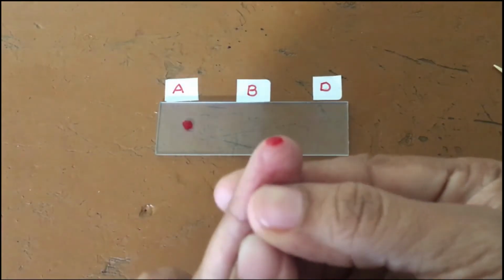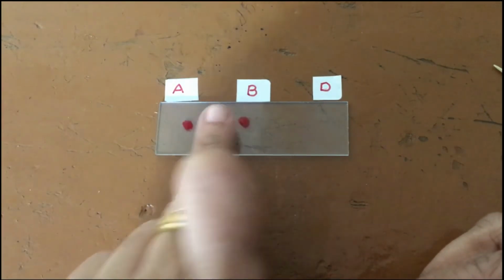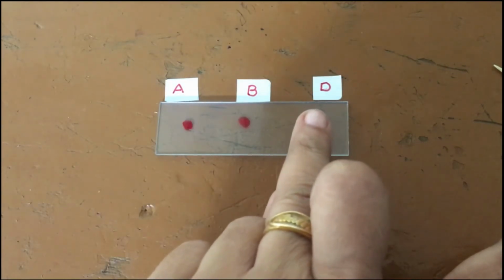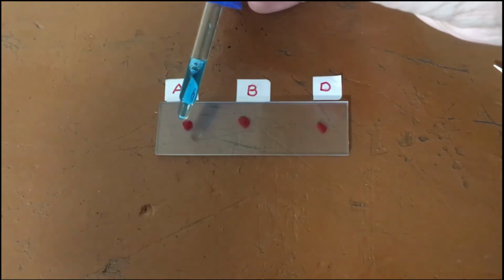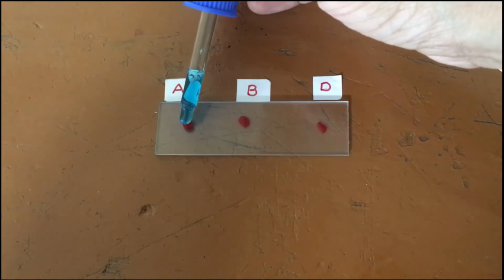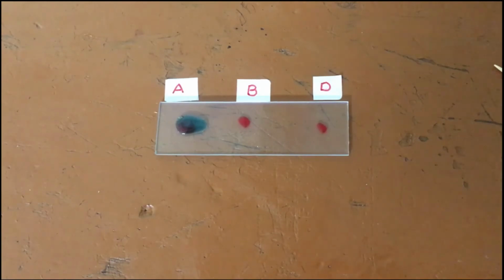By placing this blood drop, we should take care that each spot should not be too big or too small. Then after this, we need to add antisera. These are the antisera A, B and D, and separate toothpicks are also provided here. We add antisera A first to the A marked drop, and while adding, don't touch the tip of the dropper, otherwise it will contaminate.